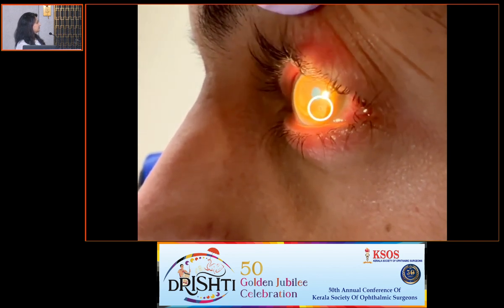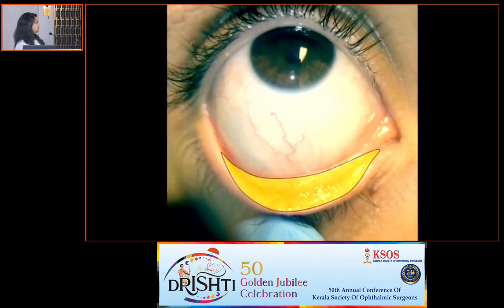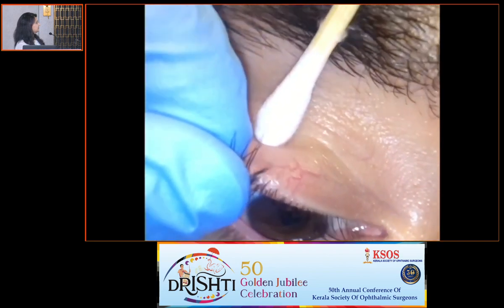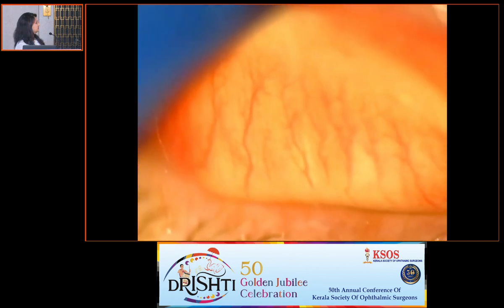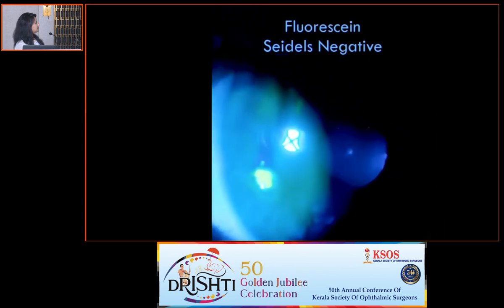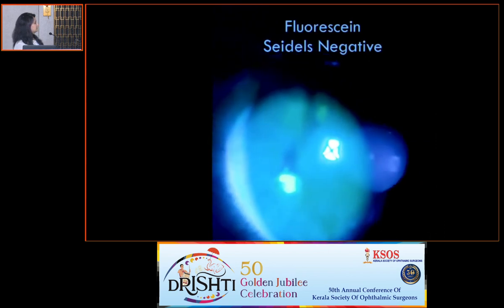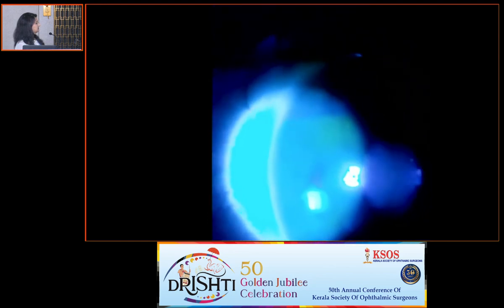We need to look at the conjunctiva and the fornix, evert the upper lid and look at the superior upper fornix as well as the lower fornix to rule out any other foreign body. Once the clinical examination is done under diffuse illumination, fluorescein staining has to be done to identify if it's a deep foreign body, is it Seidel's positive?